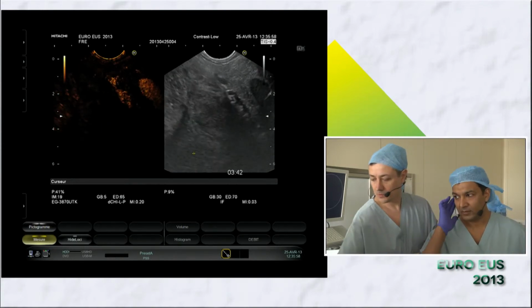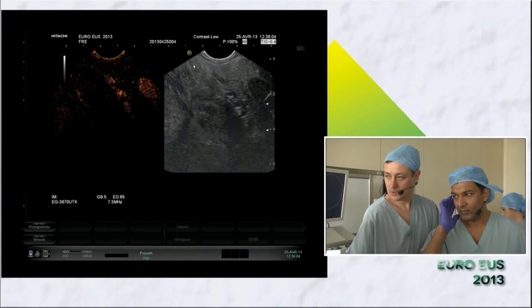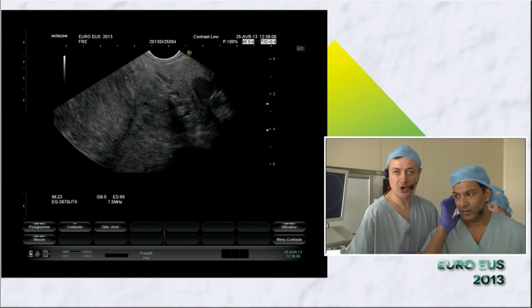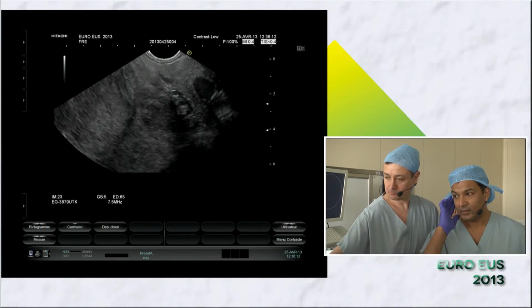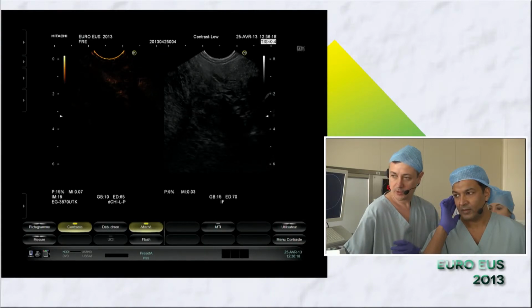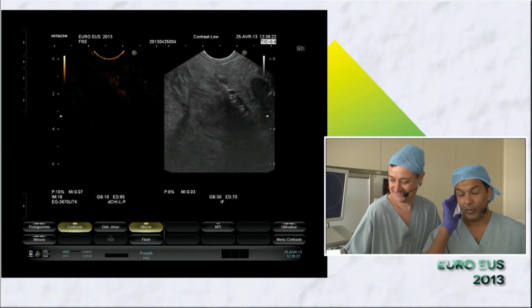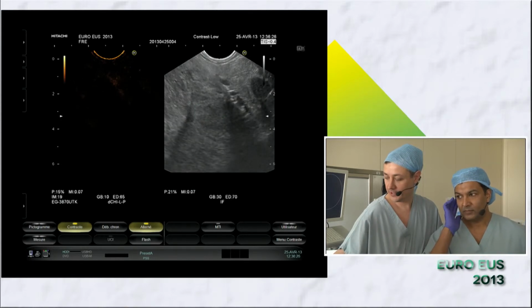There aren't probably many radiologists here, but most of them will be thinking this is a fairly obvious giant hemangioma in the liver. Yes, we can try that with contrast, see if it works. I think contrast would be very useful to see centripetal flow filling in the lesion as you go, but you're already going to be in an equilibrium phase, so we need to... Yeah, we're doing another shot of contrast. We will try in the liver lesion.